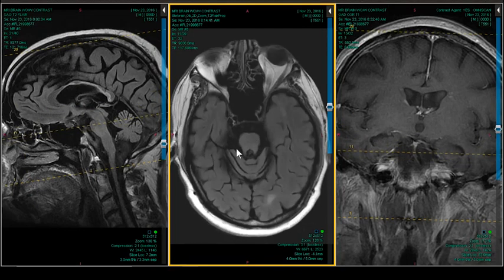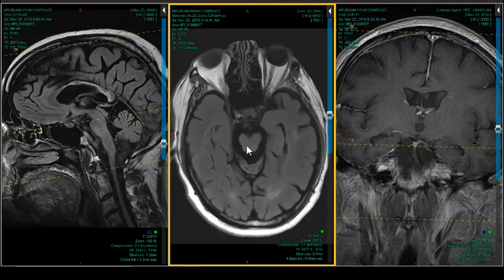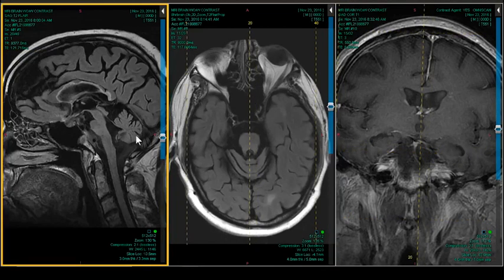I mean, this is a wiener dog little brainstem right here, isn't it? Right. Cerebellum is atrophic. And I mean, look at that corpus callosum. That is really weird. It's got some high signal throughout. I mean, it involves the body and the splenium especially. Probably comes down into the lamina terminalis. The fornix is crushed. Look at that poor fornix.